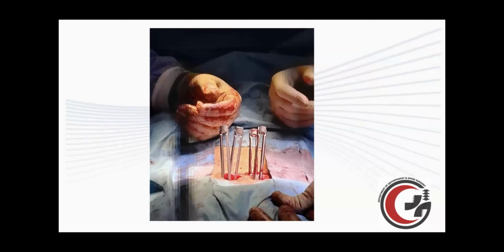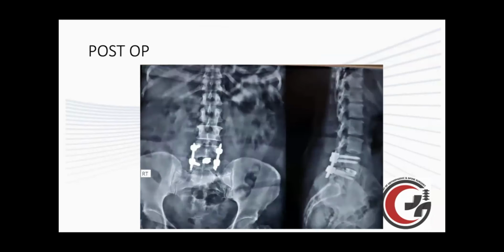And we did an interbody fusion with a cage, and this is a post-operative X-ray showing the transpedicular screws in both L4 and L5 with an interbody cage. Subsequently, on the first post-op day, she was completely pain-free. And then she went back home on the second post-operative day.